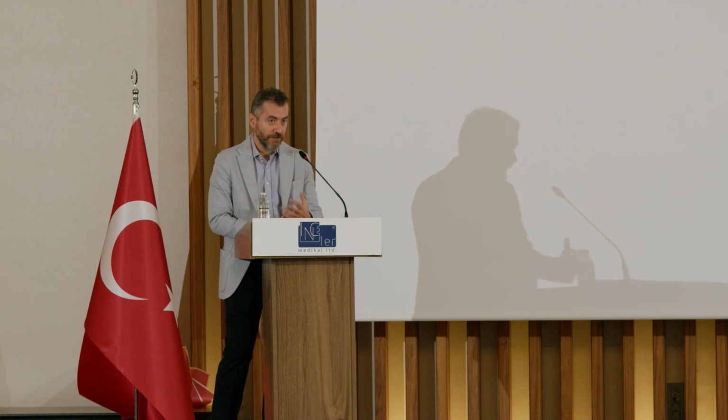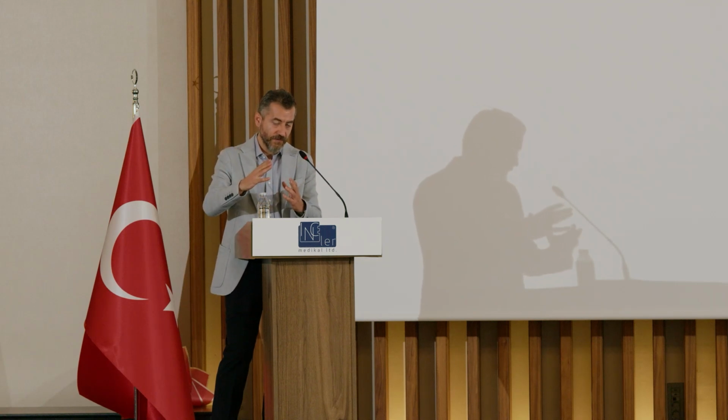The pass-the-ball technique I apply very regularly. And I actually published 2 different studies just to evaluate the role of the retrograde access. And we found that if we do a retrograde ureteroscopy at the end of the procedure, we can reach all of the collecting system in about 95% of the cases. And we improved our stone-free rates from 70% to more than 90% with the application of this. But you are right, it's always a problem.